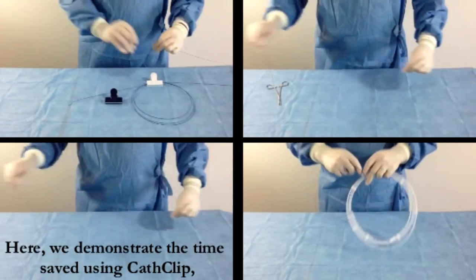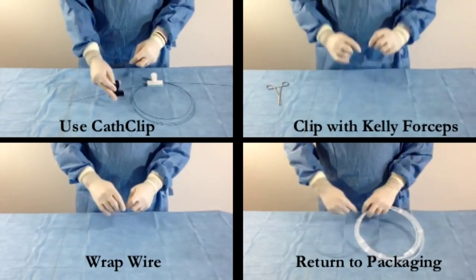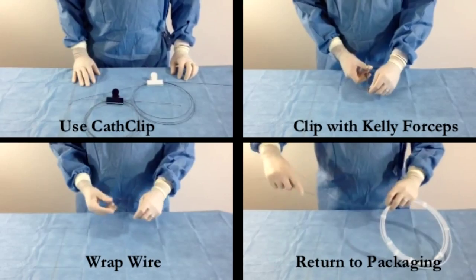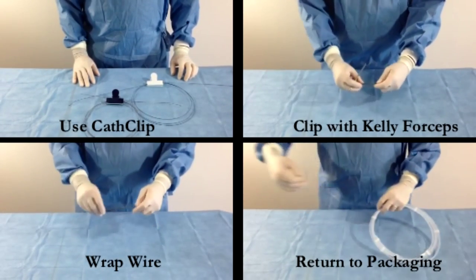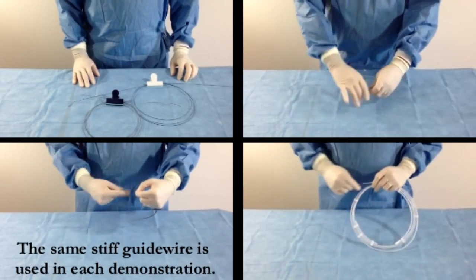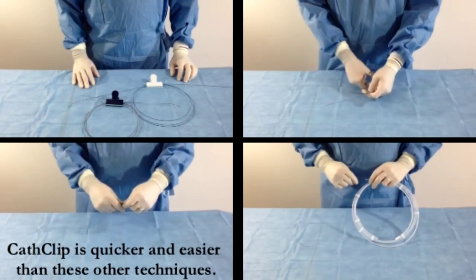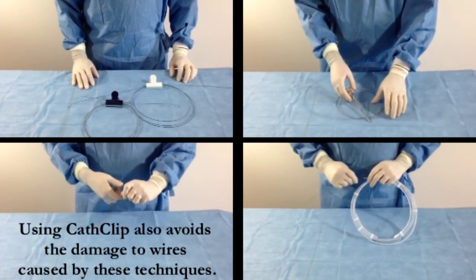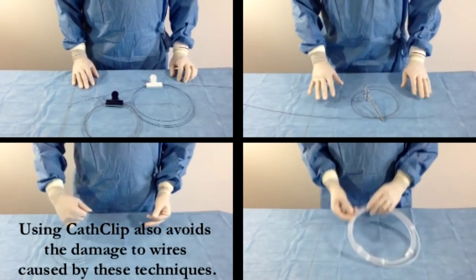Here we demonstrate the time saved using CathClip as compared to common wire management techniques. We compare using CathClip, clipping the wire with Kelly forceps, wrapping the wire around itself, and returning the wire to its original packaging. The same stiff guide wire is used in each demonstration. CathClip is quicker and easier than these other techniques, and using CathClip also avoids the damage to wires caused by these techniques.